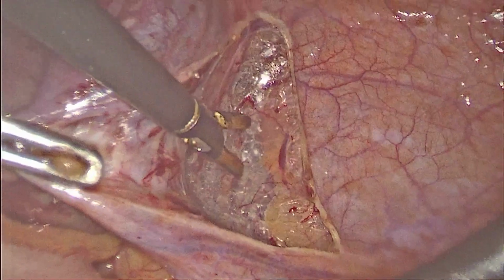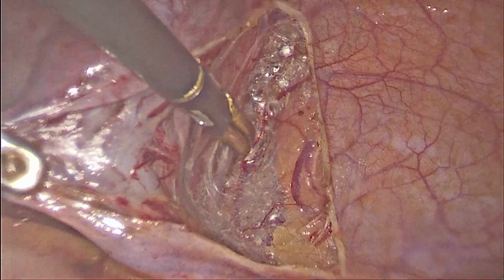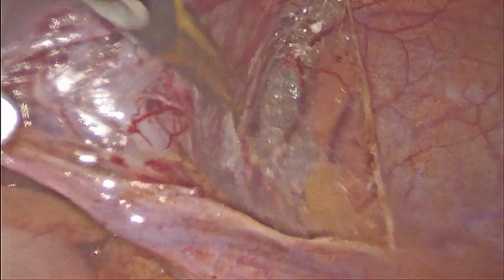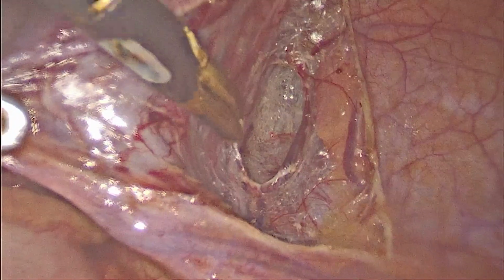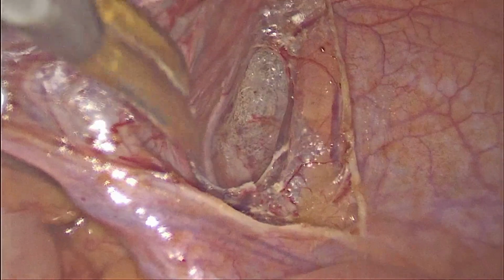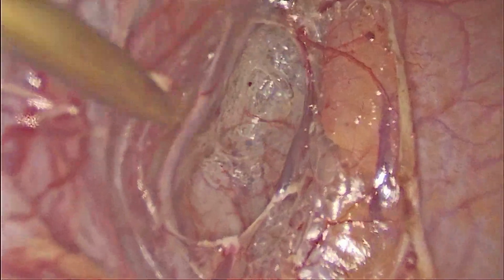Bipolar shearer was used to enter this place, which showed very good hemostasis when the dissection was carried out. Now we are reaching nearly to the ureter, which was confirmed by peristalsis. So that is the ureter we identified.